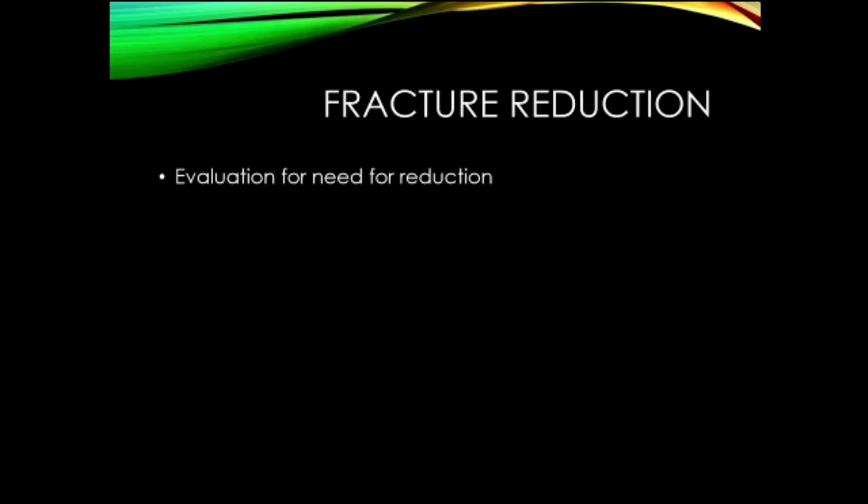So there have been some studies looking at fracture reduction with variable results. There was, particularly in the pediatric literature, because these are the folks that we don't really want to expose to a lot of radiation. So you get the initial X-ray or you do the initial ultrasound, and the ability to predict whether these fractures needed reduction actually was in a couple of studies pretty variable.